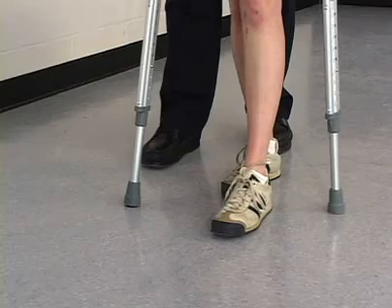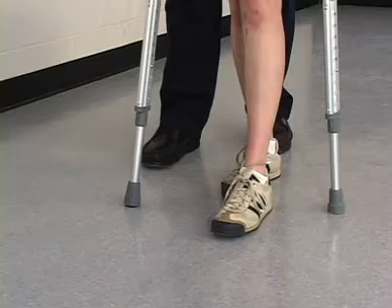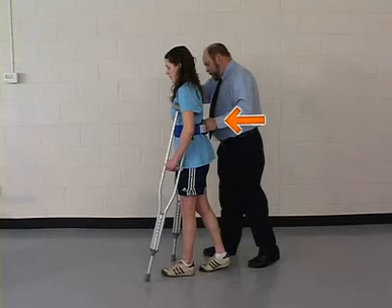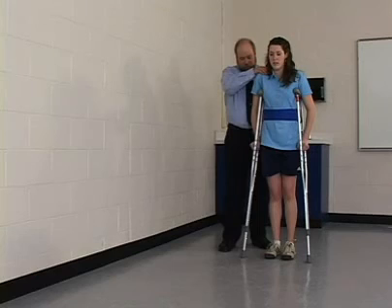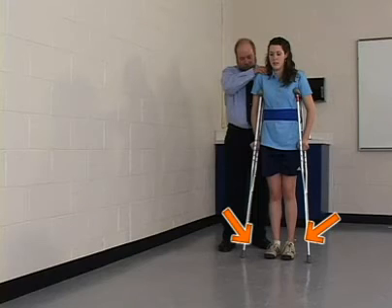Ambulating using a four-point gait pattern begins with the therapist positioned in stride behind and to one side of the patient. Again, the therapist grasps the gait belt and shoulder of the patient. In the starting position, the patient stands with the crutches in the same position used for determining crutch fit. The patient's feet are side by side.